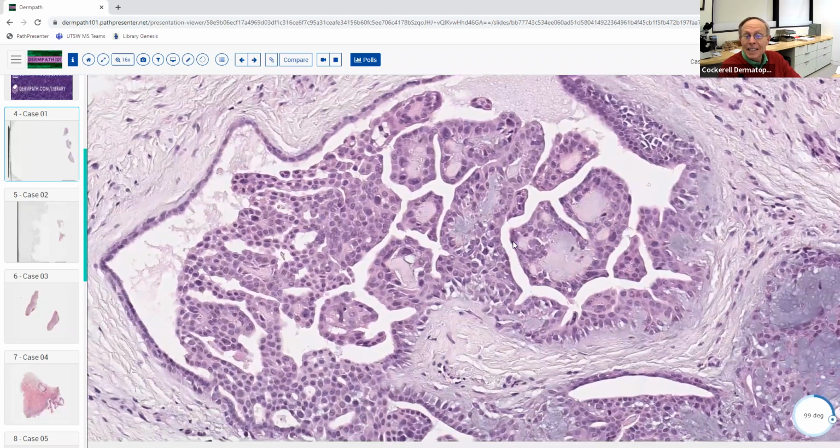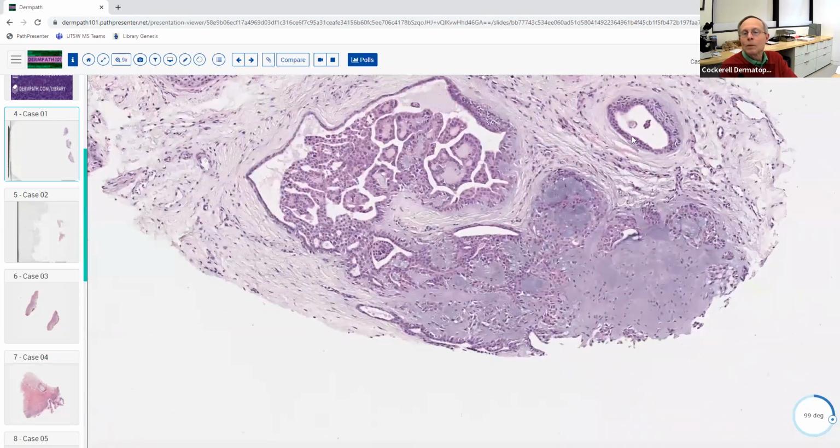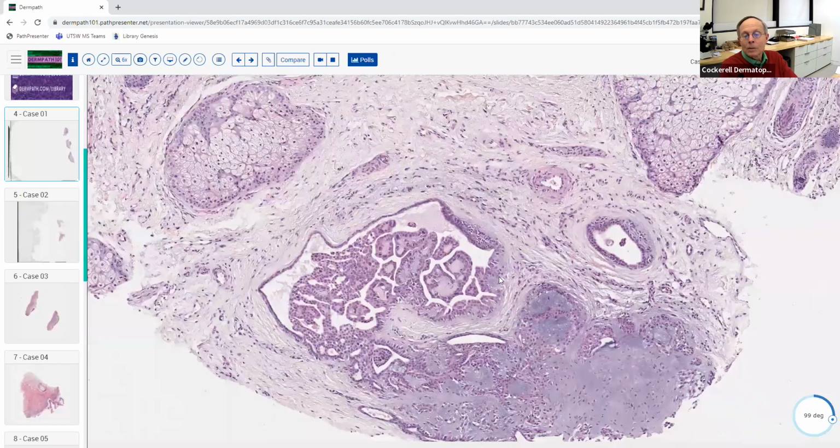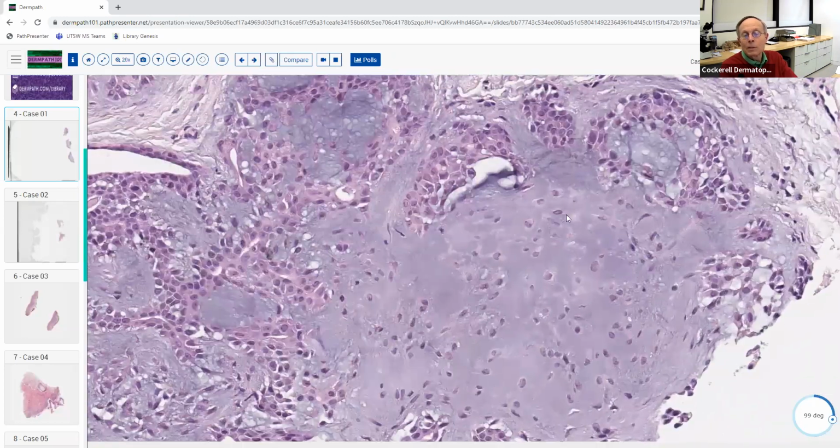Like if you were to just see this lesion alone right here without the other, you'd probably think of that maybe being more like a tubular adenoma of some sort. And maybe some of these cells almost begin looking like they may have some apocrine differentiation. They're larger, they're more epithelioid in a way. They may even have a little bit of snouting on them. So you can see that this doesn't look like a classic field of a chondroid syringoma. This doesn't look like a syringoma at all here. So just realize that even though we describe everything in a book chapter, in the real world, things sometimes look a little bit different. So that's good. So this is a nice example of what we call a mixed tumor.